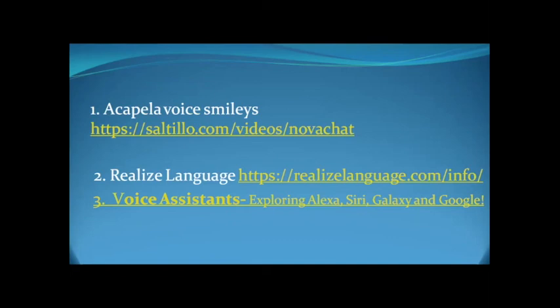That's neat. I don't think I had anything else. It's cool they're incorporating all that in. As much as you can get somebody to use a device, the more they're going to be interested in it. For the kids, sometimes it's not about communicating, right? It might be about using it, and then when they need it, they'll be able to use it, hopefully. Oh, that's really neat.